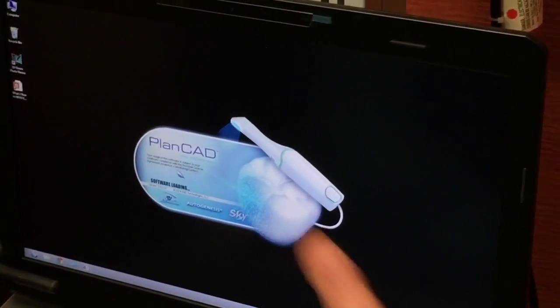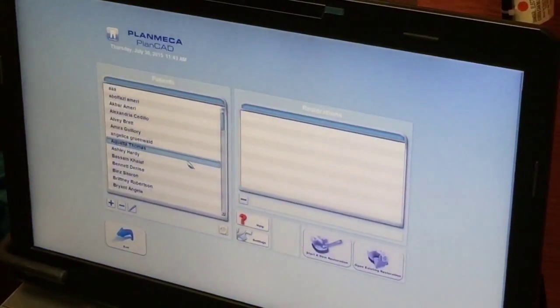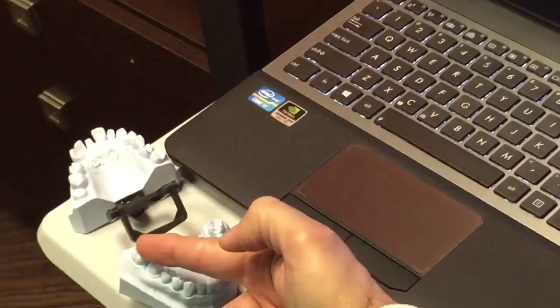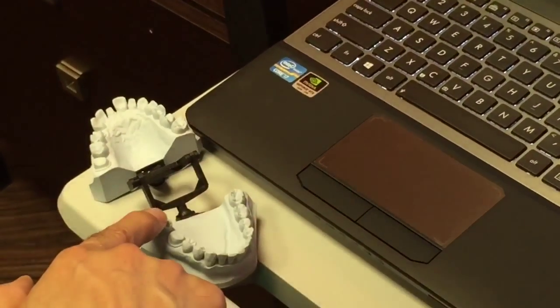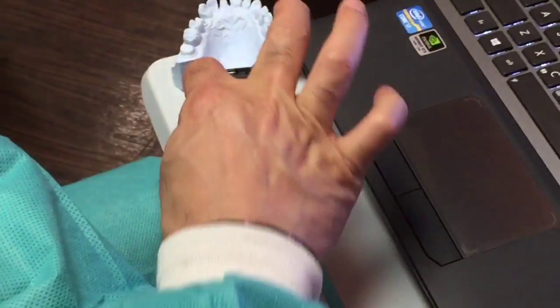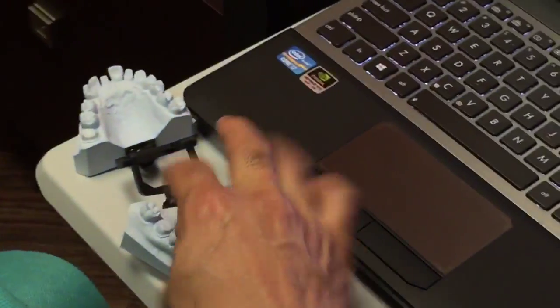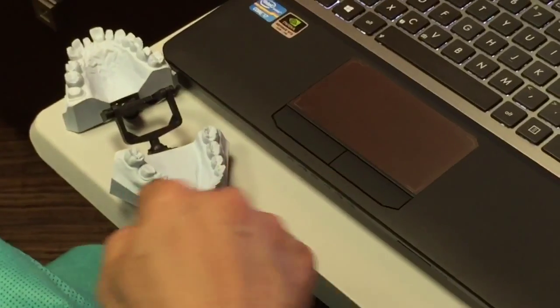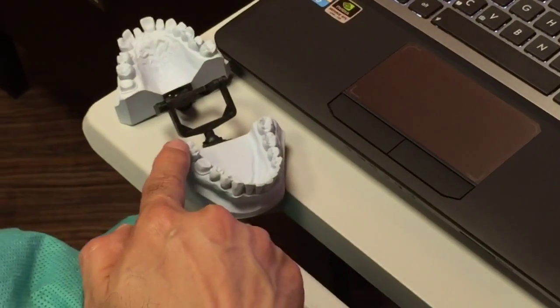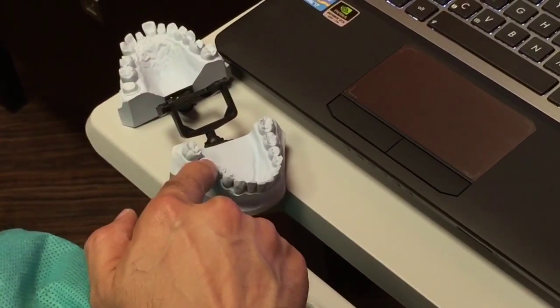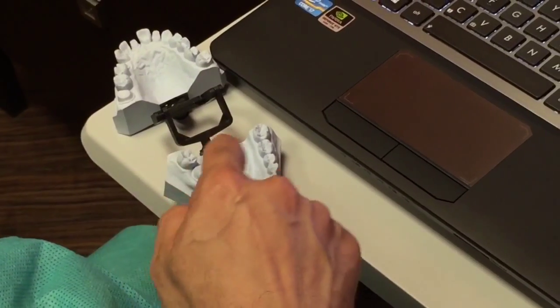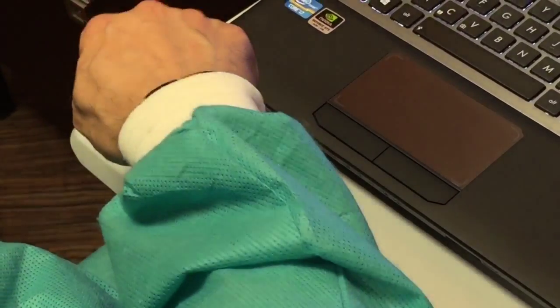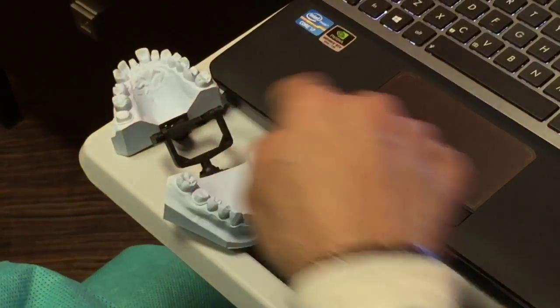When you use the scanner, the tip of the scanner should start from the distal. You always scan the tooth in the back and the tooth in front of the prep. You only need one teeth on either side. You don't have to scan the whole arch. So if I'm prepping number 30, I only need the scan of the neighboring teeth, 29 and 31.